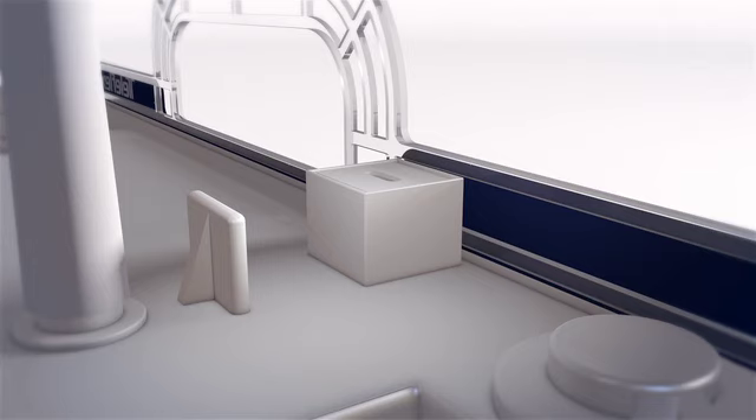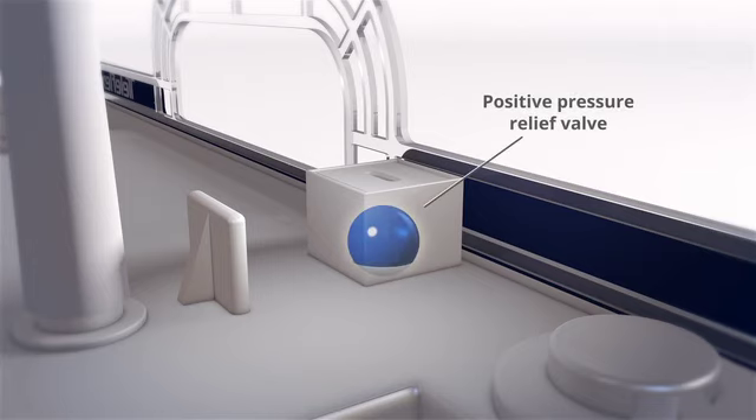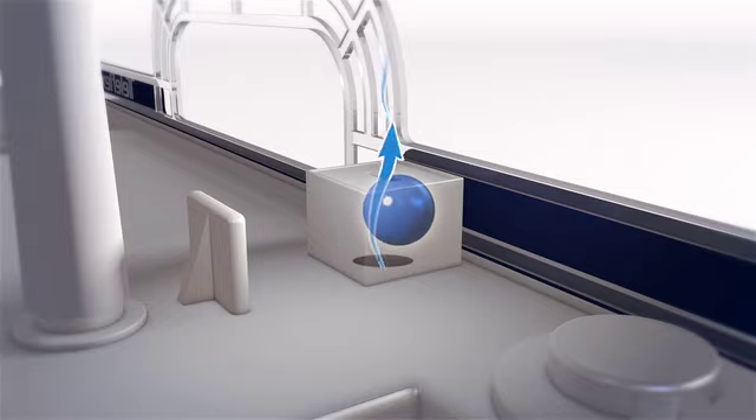On the top of the unit above the water seal is the positive pressure relief valve. If suction tubing is blocked or occluded in any way, this valve provides a backup for air to exit from the Plurivac unit.